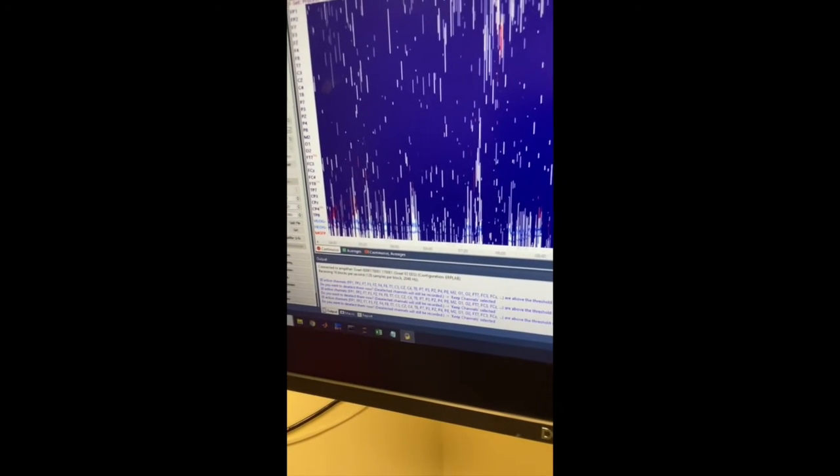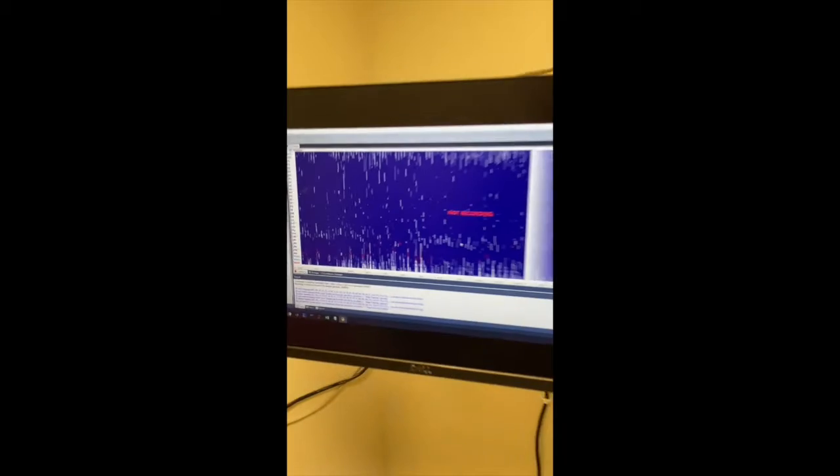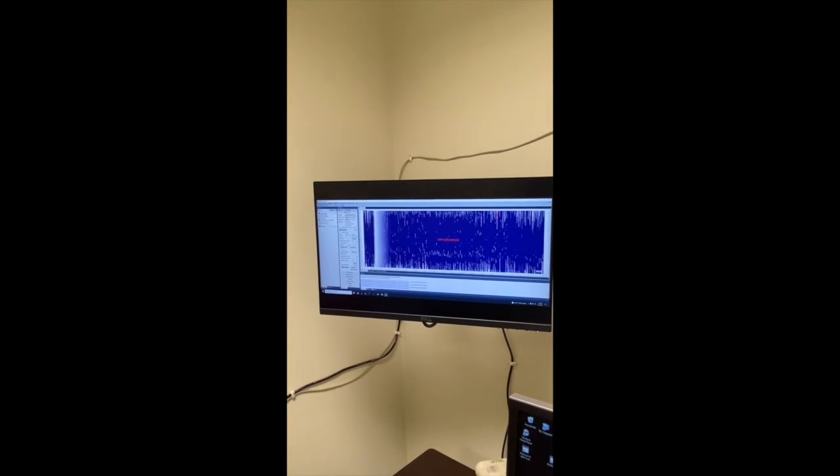Encourage the participant to blink and then point out the spike on the VEOG and HEOG electrode channels on the graph. Explain to them that excessive eye blinking and movement are discouraged during the testing portion of the study as it interferes with the ERP data we wish to collect.